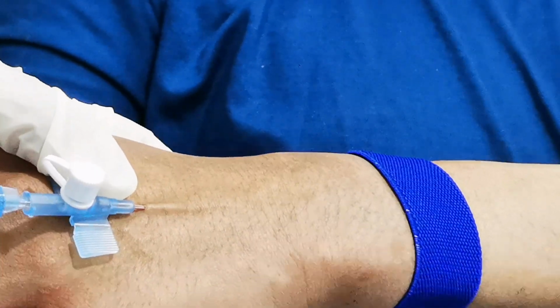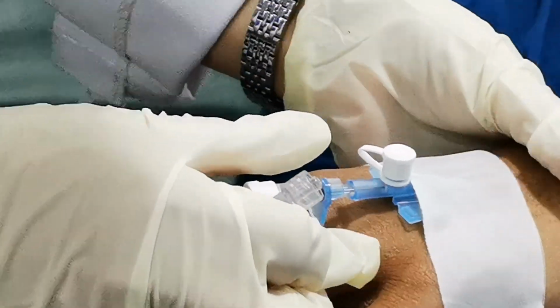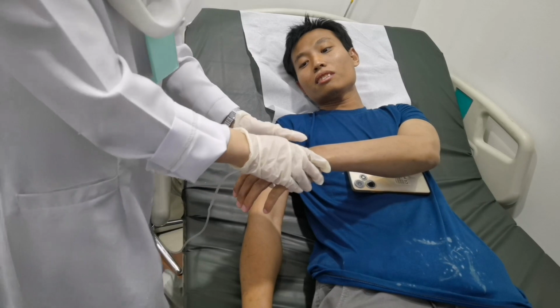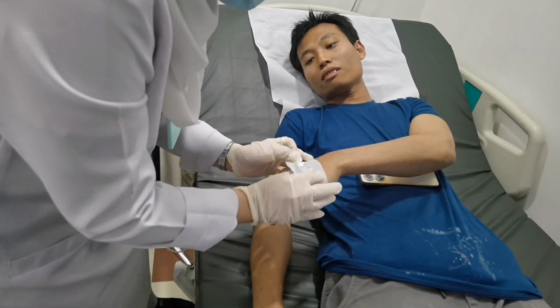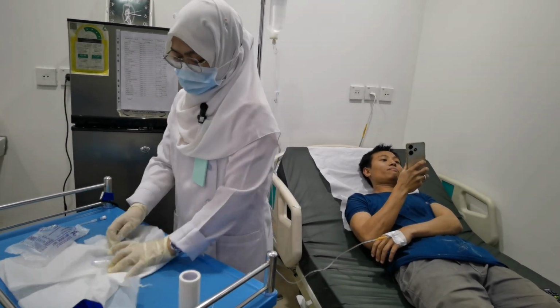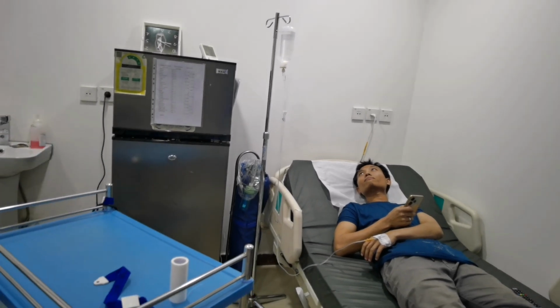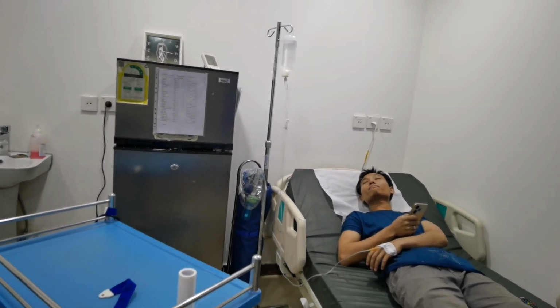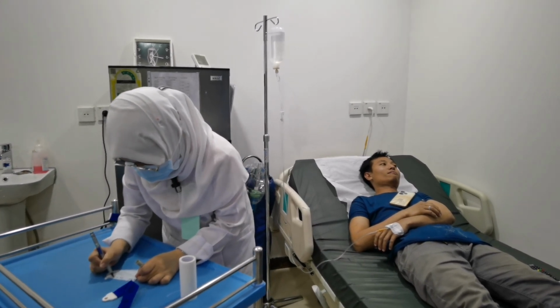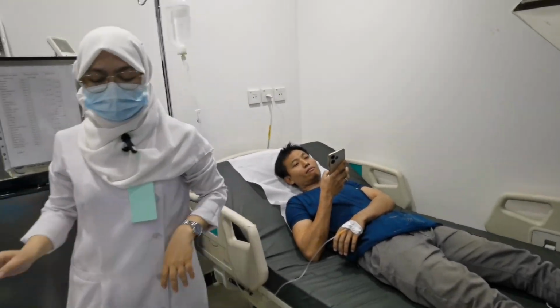And then release the tourniquet. Secure the site with a plaster. Completely remove the needle and then attach the catheter to the IV set. Secure the site with another plaster. Clean your working table and make a note with name, date, time, and number of drops per minute for the IV drip. And lastly, perform hand hygiene and document the procedure you have done.